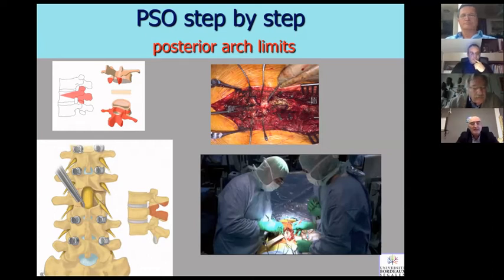It takes time. Using the burr, you create 2 rails there, and you can remove after that the bone with a big Rongeur so that you can keep the bone for the graft after that. This is very important. The main thing is to avoid making bleeding. So using the burr to do the 2 rails, one on top, one on bottom, and then you remove laterally the bone and you will see the spinal cord, or if it's below L1, all the nerve roots, of course.